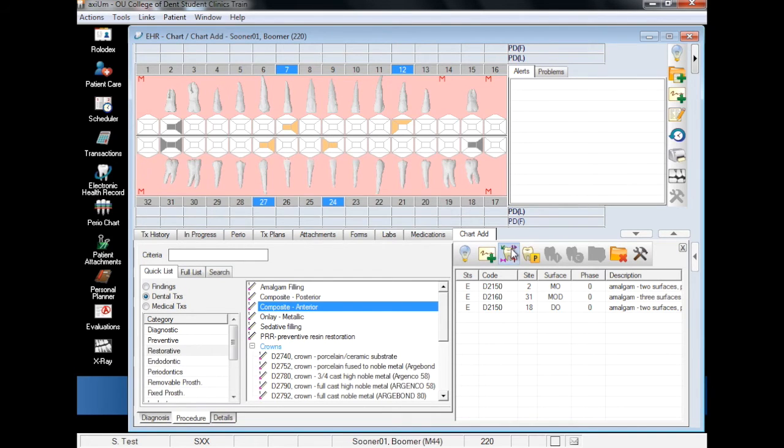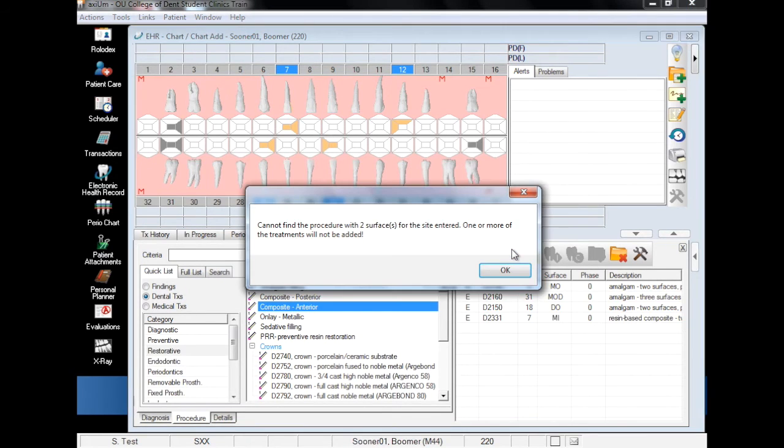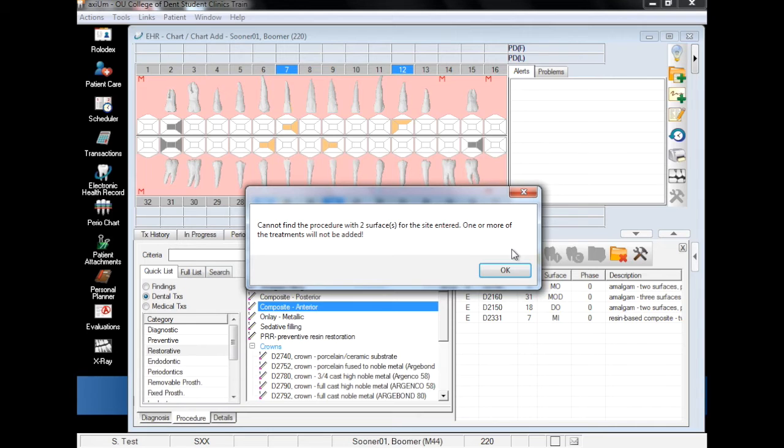Finally, click on the Add Findings button to add them to your list. Including a posterior tooth with the anterior composite group has caused a prompt to alert the error and the composite is not added to the tooth.